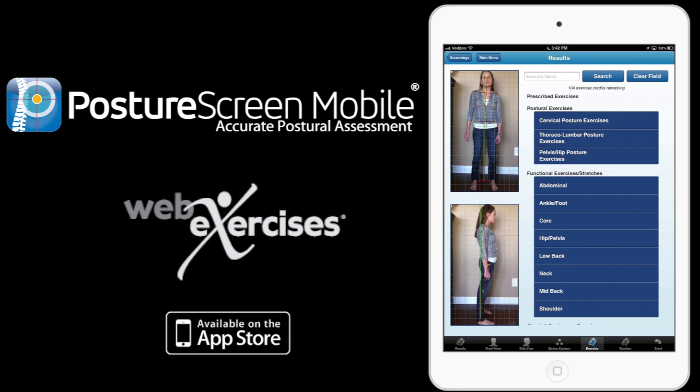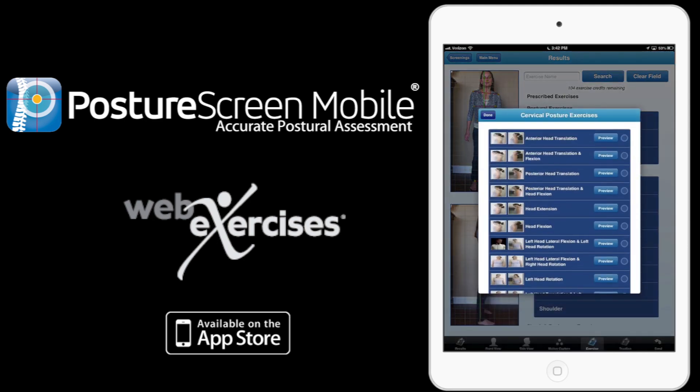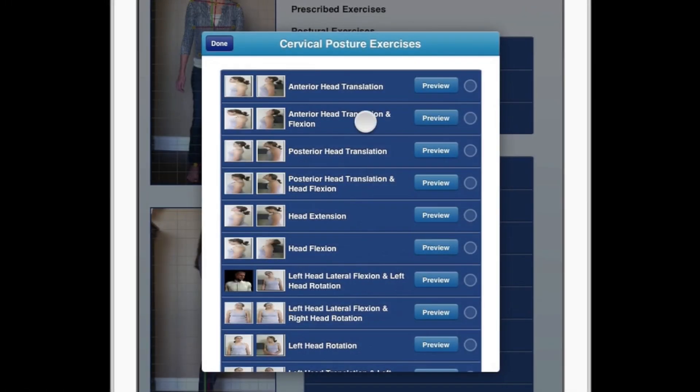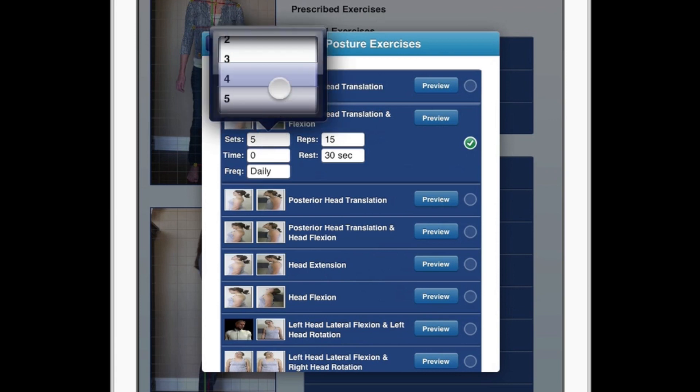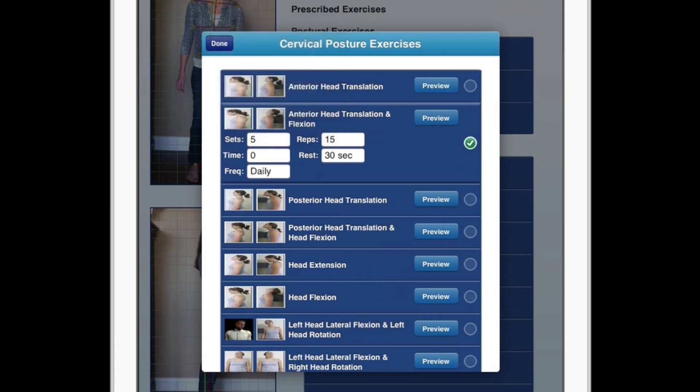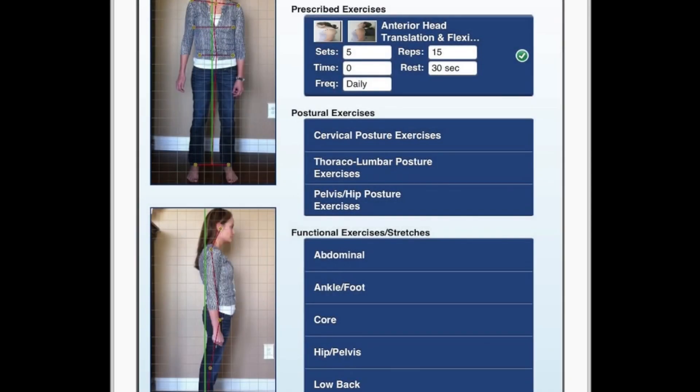Getting back to this, we have pictures of what her posture looks like over on the side here. I'm going to start with some mirror image postural-based exercise protocols and match what she has. She has anterior head translation. I want to go ahead and give her five sets, daily, as I've already prescribed this exercise previously.